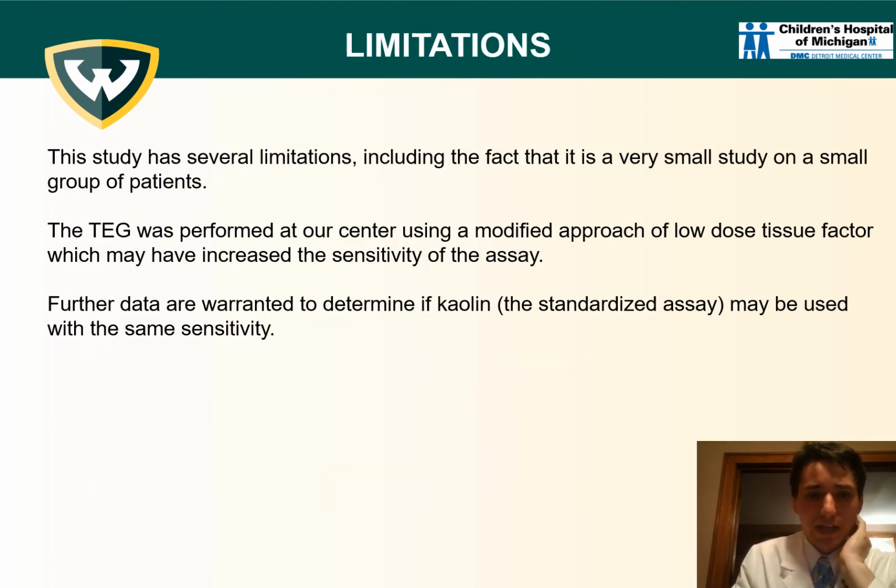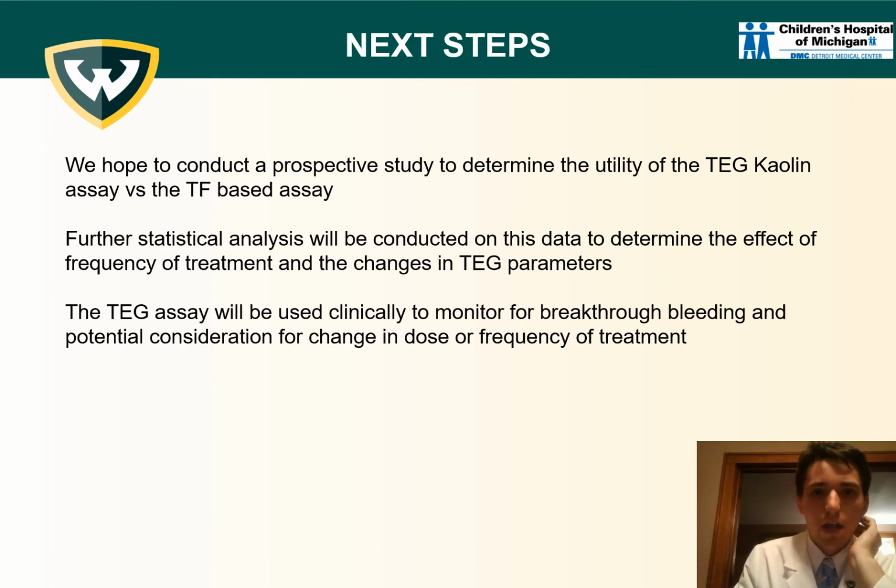There were some limitations with this study. It was a very small study, and some centers use kaolin, some centers use tissue factor, so even the TEGs themselves are not quite standardized across centers. So we want to do further tests with more patients and different techniques to determine if this effect is the same. Once again, next steps, we hope to do some more statistical analysis as well to better characterize the efficacy of TEGs to monitor patients on emicizumab.